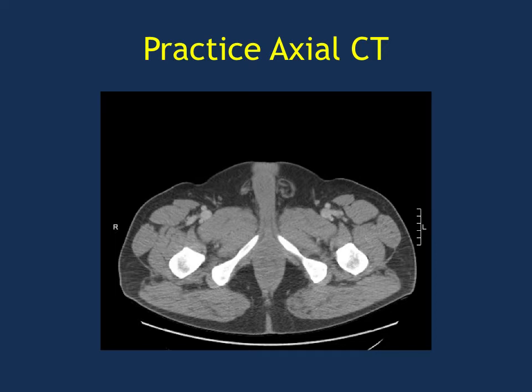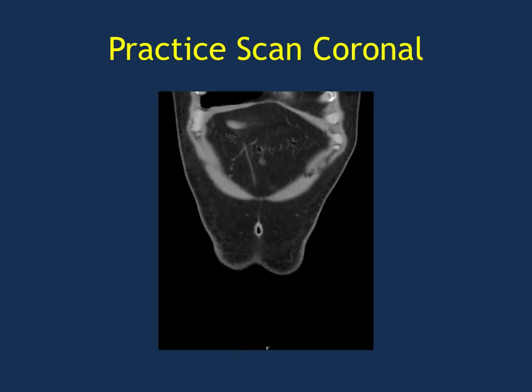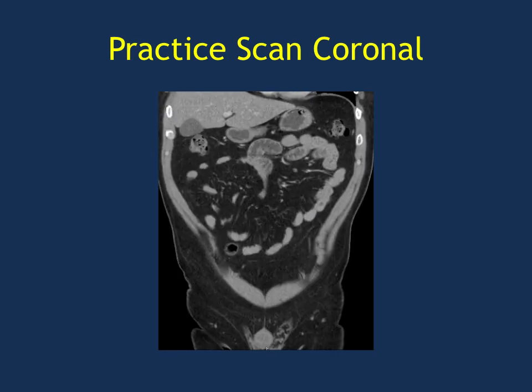So you want to start, let's say, from the bottom up. Make sure you look at the rectum, look at the sigmoid, look at the descending colon, look at all the colon. Make sure that you've told yourself you've seen all these. Right. And that's what I'd recommend. I think for the large bowel, I would start at the rectum and then move on up. And then for the upper GI, start at the esophagus, go to the stomach, and try to at least get to the duodenum. Yeah, you should be able to see all 4 parts of the duodenum and get to the proximal small bowel until it sort of gets decompressed and lost.